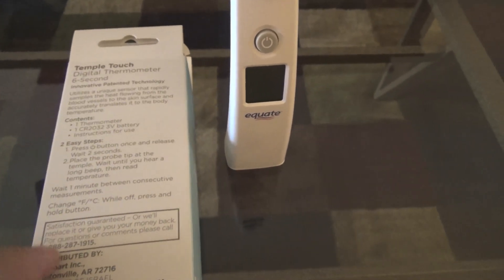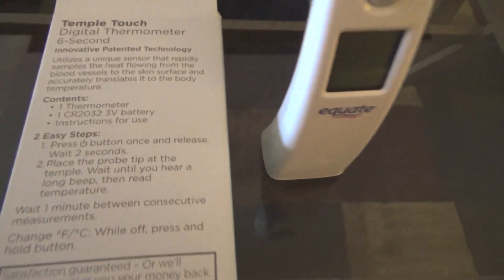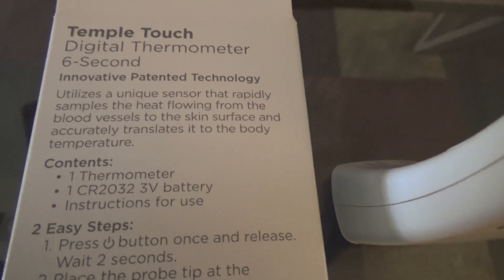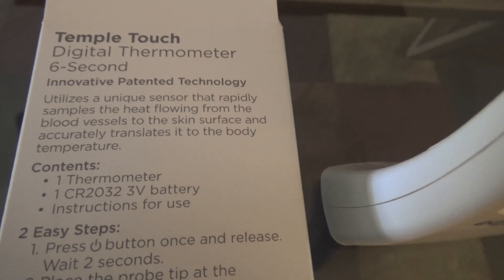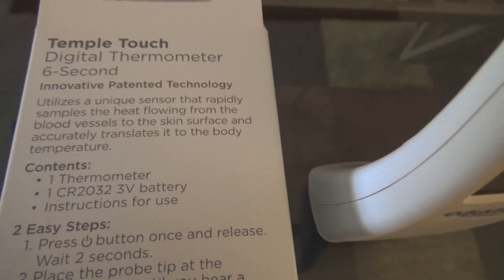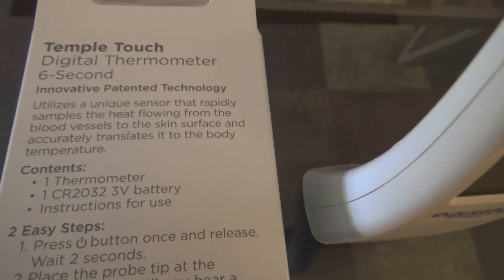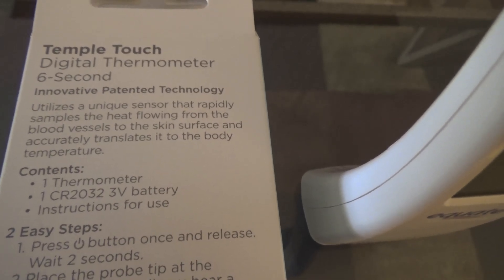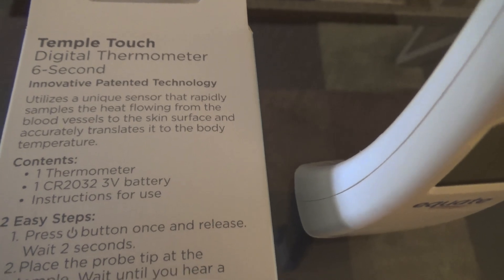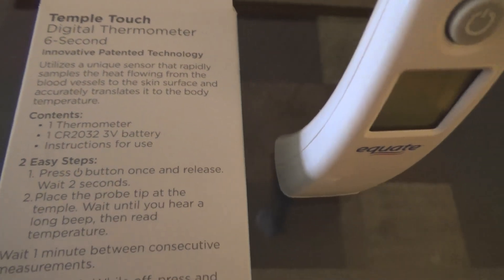Some other information: it uses a unique sensor that rapidly samples the heat flowing through your blood vessels and translates it to body temperature. It also comes with the battery already installed.